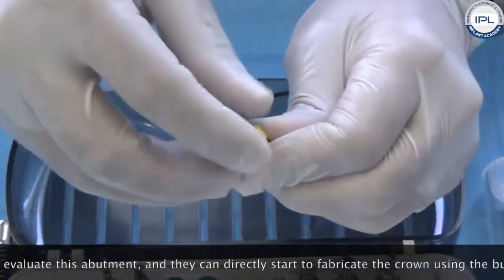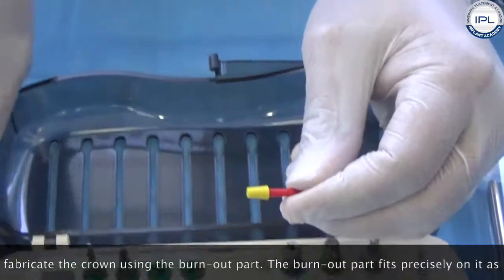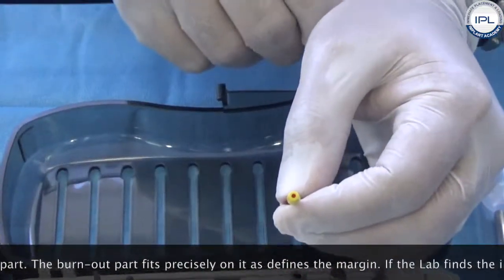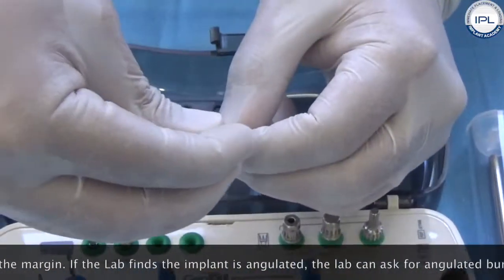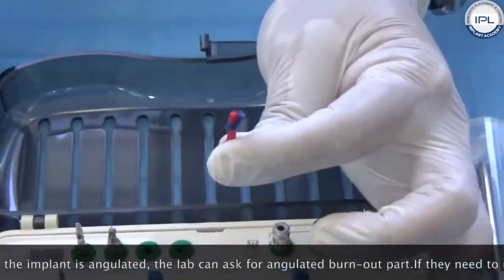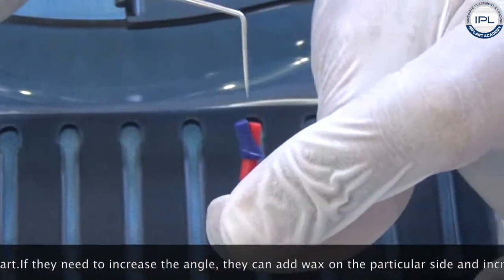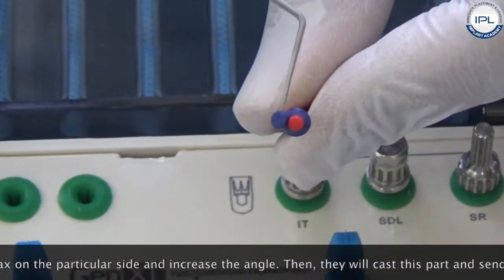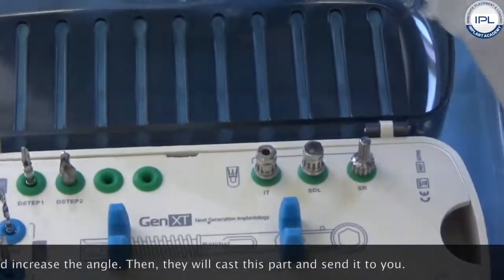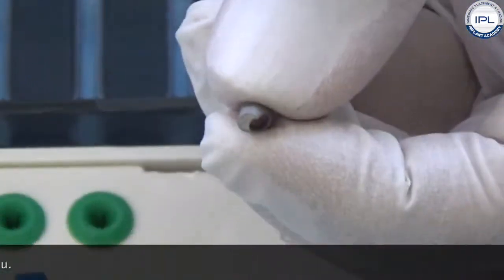They fabricate the crown using the burnout part, which fits precisely on it and defines the margin. If they find the implant is angulated, the lab can ask you for the angulated burnout part. They place it, add wax on a particular side to increase the angle as needed, then cast this part and send it to you.